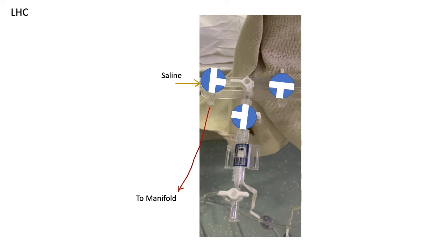And just as before, if you flip the middle valve 180 degrees to the right, this will change the configuration of that valve and allow a communication between your transducer and the pressure at the manifold.